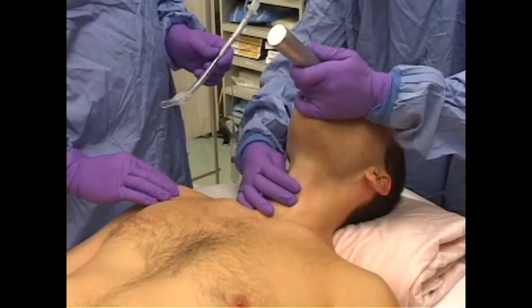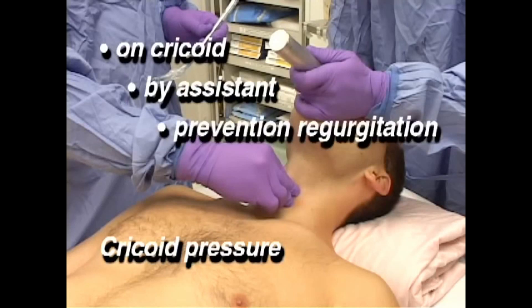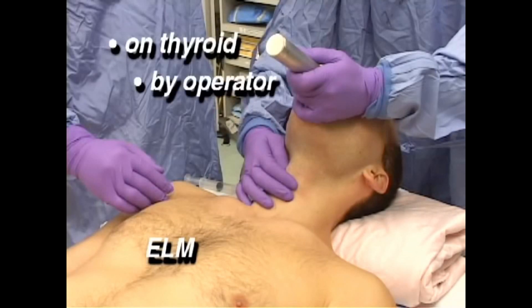Bimanual laryngoscopy, or ELM, is not cricoid pressure. Cricoid pressure is done by an assistant to prevent passive regurgitation of stomach contents in high-risk aspiration situations. Bimanual laryngoscopy is deliberately done to improve laryngeal view.